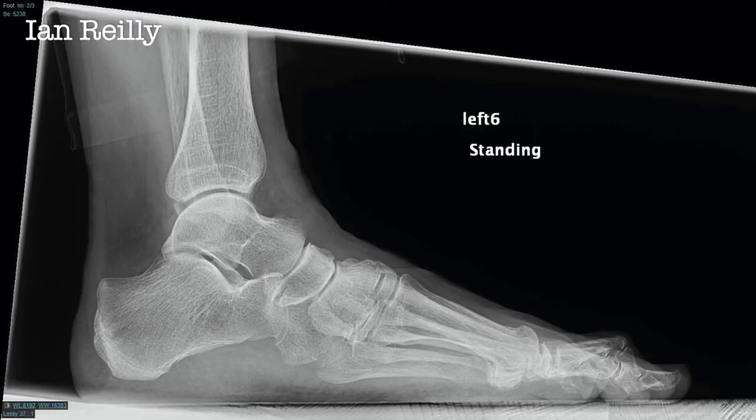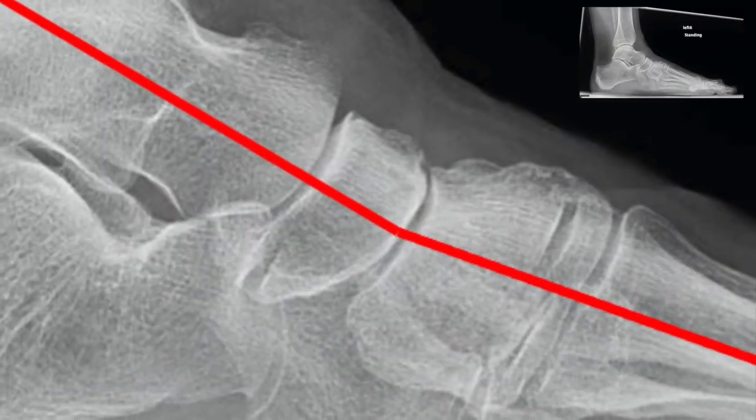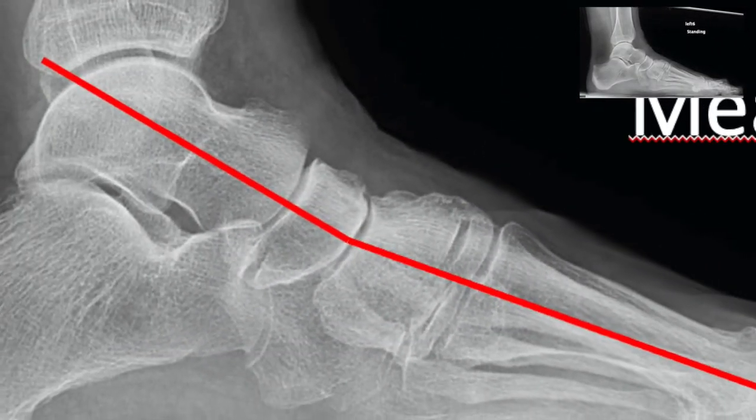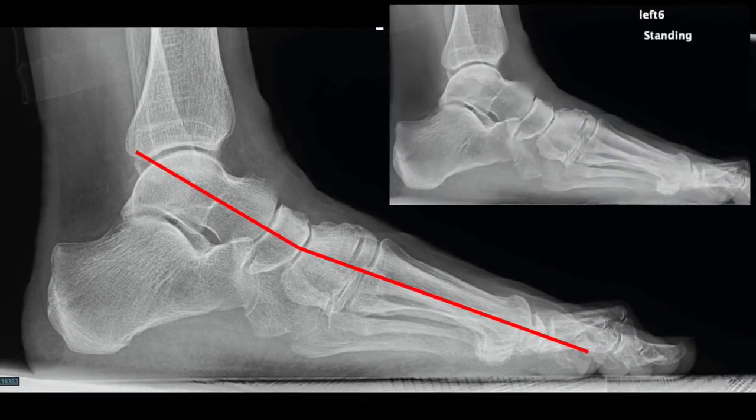On the lateral view, zooming in, you can see there's a little bit of navicular cuneiform sag. If you were to take a line — Meary's angle — through the talus and the first metatarsal, you'll see there's some sag around the navicular cuneiform joint.